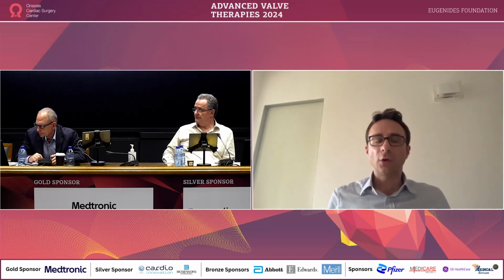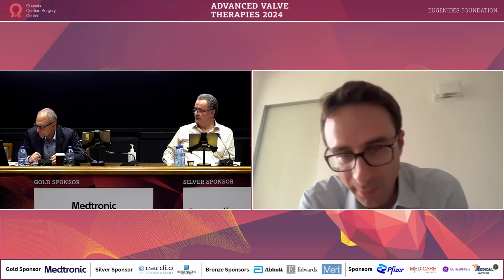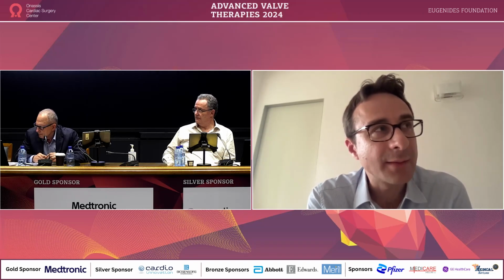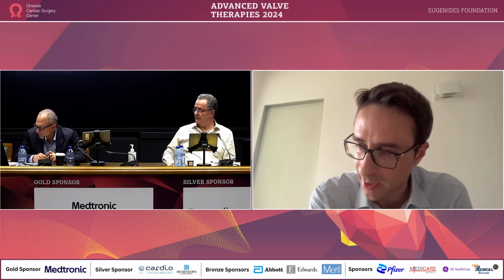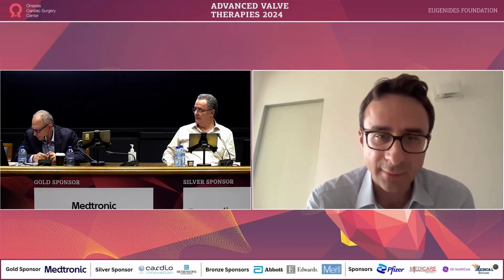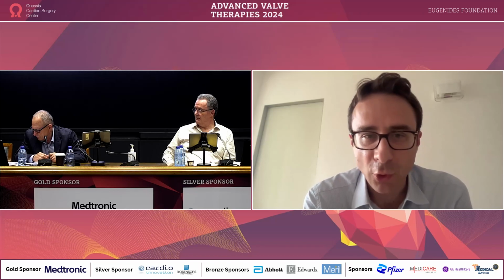Yeah, in regard to novel devices, I think that some of them are actually very similar to the two principal ones, especially the Omega, which I think is quite similar to the Amulet one. In my clinical practice, sometimes in specific anatomy, I prefer to utilize a device like Lambre, in which you have special sizes, different sizes of the lobe and the disc, and you can easily anchor the device in anatomy that I would otherwise consider challenging with the more common devices.